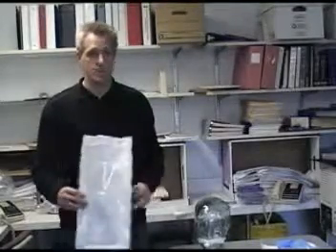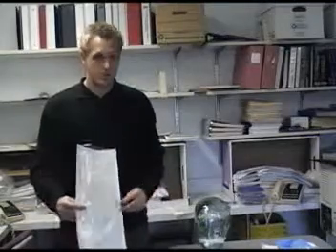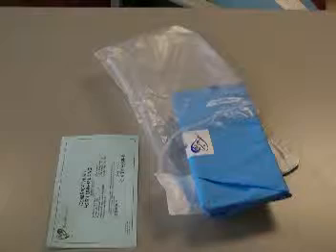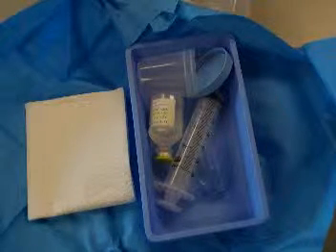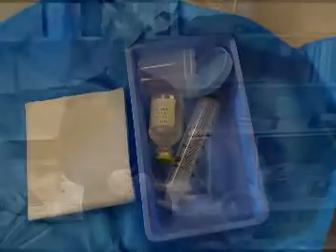All right, now you're ready to go ahead and insert a Combicath. You've gotten the physician order to go ahead and do this, and now you're ready to start. Two things you need here at the University of Maryland are one, a Combicath, and second is the Combicath kit. Inside the kit contains everything you're going to need to go ahead and do this. The only thing that's missing are the sterile gloves as well as a mask to go ahead and do the procedure. Obviously these are size specific, so you go ahead and choose the ones that fit you.